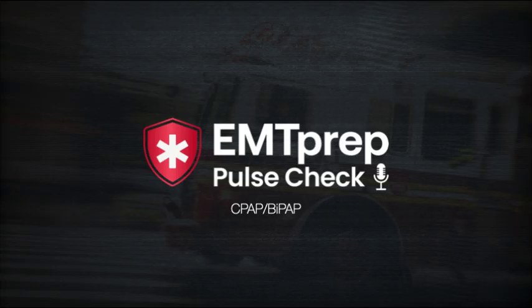And the best part is we can keep that end-tidal CO2 cannula on, like I said, and this will allow us to consistently monitor waveform capnography. We may also administer an inline DuoNeb in conjunction with BiPAP if indicated. And once again, we're going to reevaluate frequently for desired effects: an SpO2 above 94%, work of breathing improved, as well as lung sounds improved.